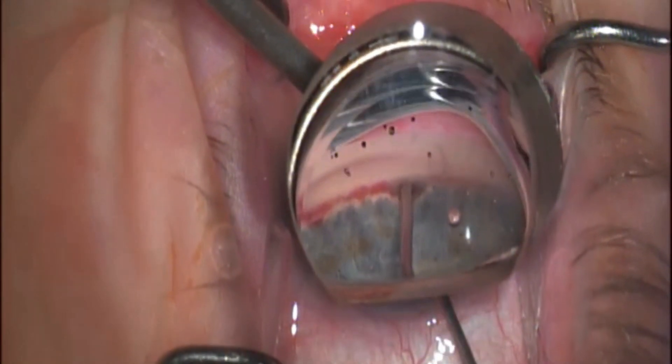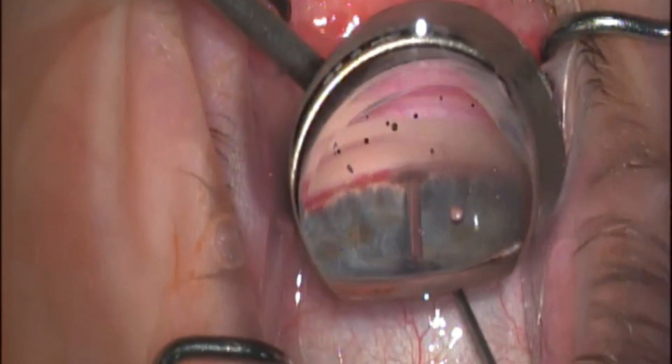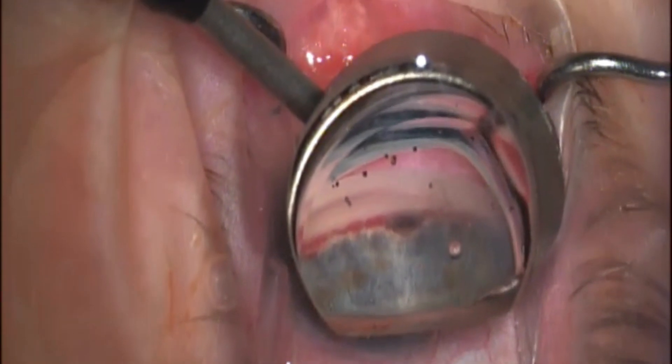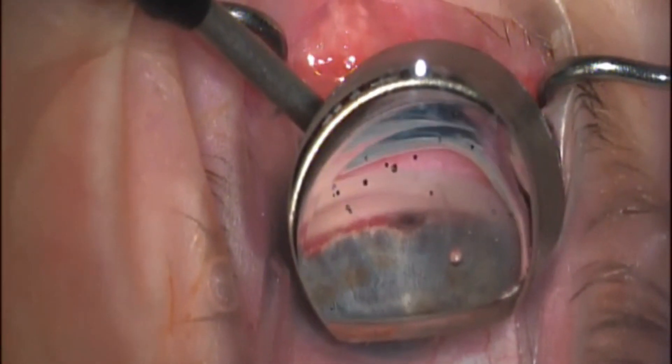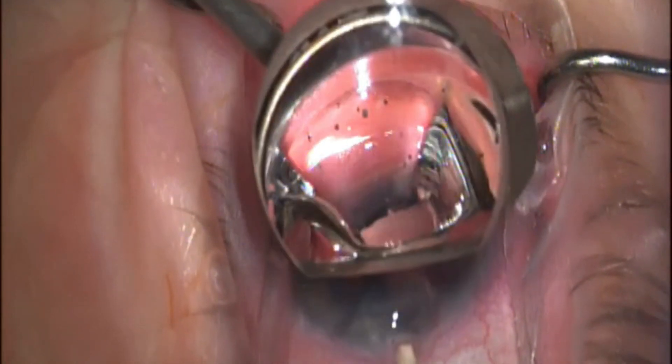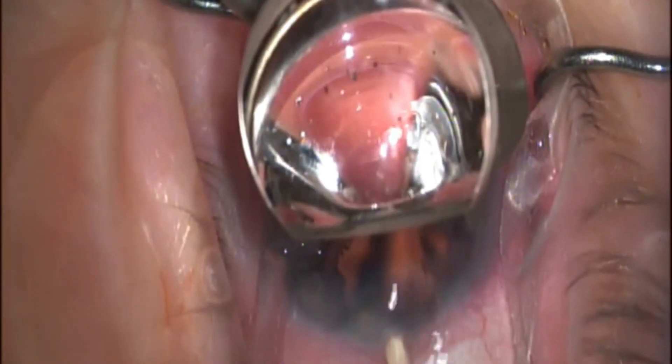I'm going to advance the cannula into that supraciliary space, and as I advance it forward I actually inject some viscoelastic. That helps me tamponade any potential blood that might want to move anteriorly into my view. Once I have a nice little open space like you're seeing here, I'm then able to bring in the actual injector device itself.